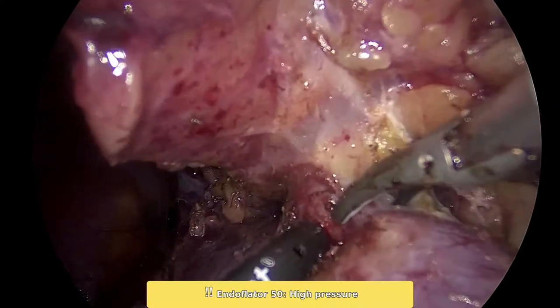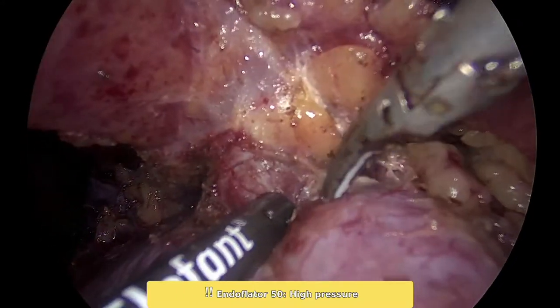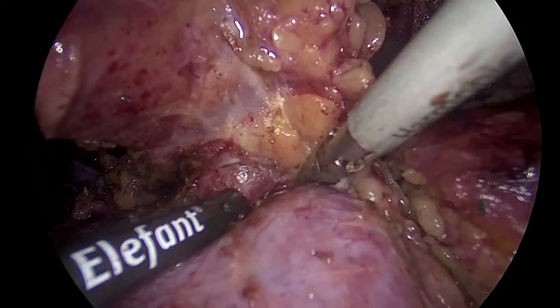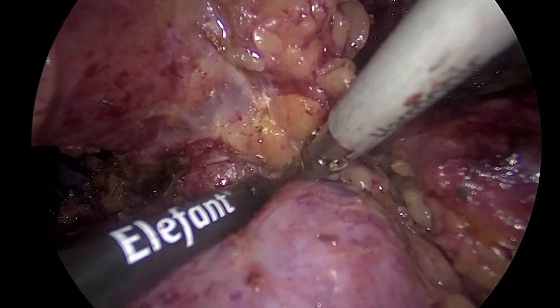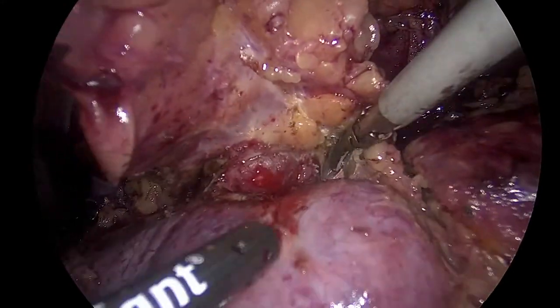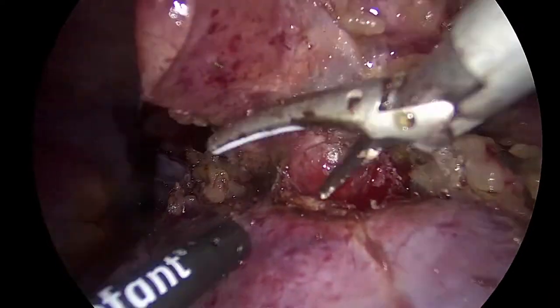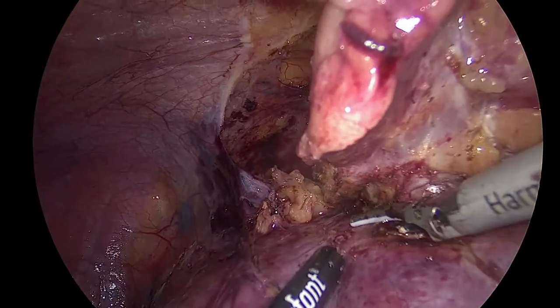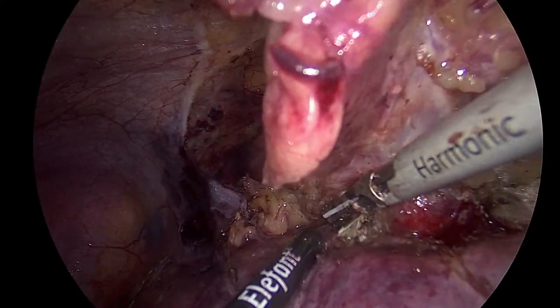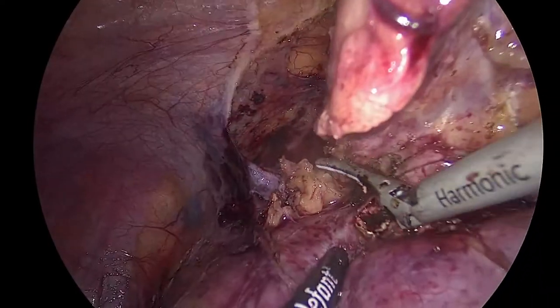Come in. Show me left. Be careful of your orientation. Orientation is important here. Good. Show me. Show me here to the left. You already made your enucleation, I think so. More or less.